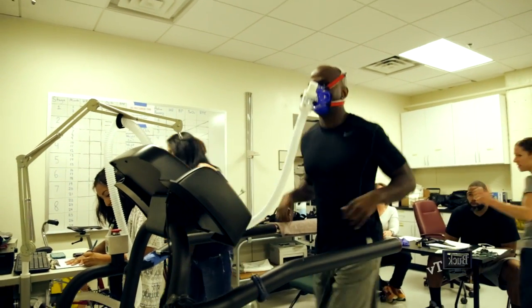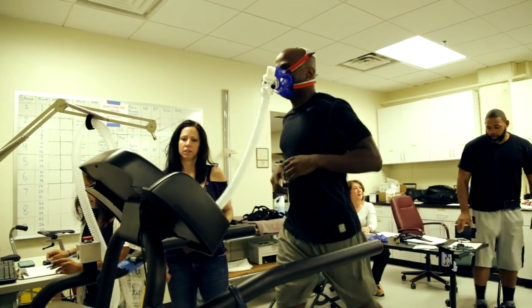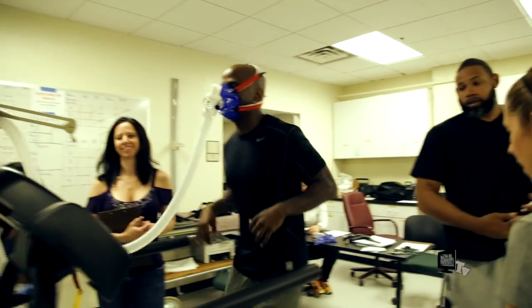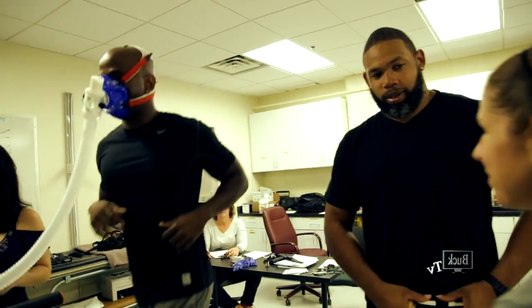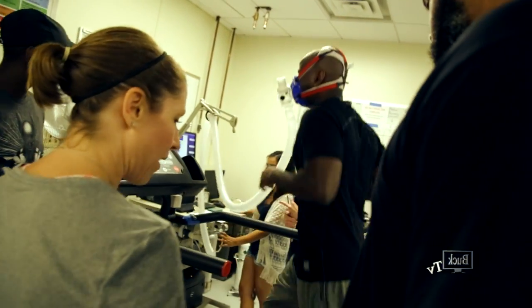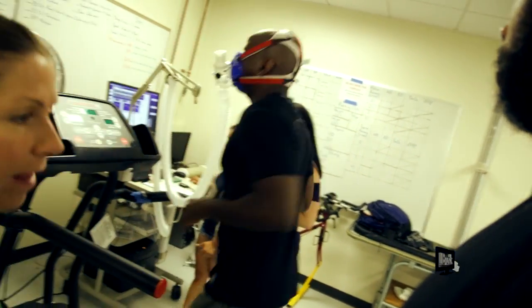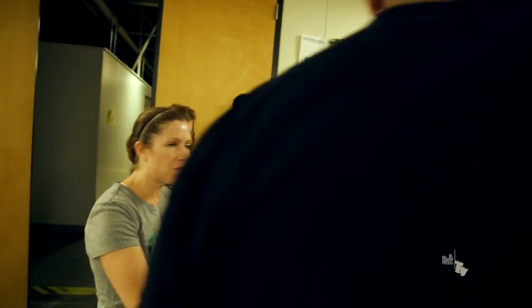Andre, you want to be the assistant to the subject? So what that means is, you're the only one big enough to catch him if he falls down. You would stay by him. He tends to run back towards the back of the belt. That's his thing, and I told him not today. If we notice, especially towards the end of the test, that he's drifting too far back, you just say, stay up on the front of that belt. In the event he reaches maximal exhaustion and loses his balance, we're there ready to help him out. Probably it won't be until later.